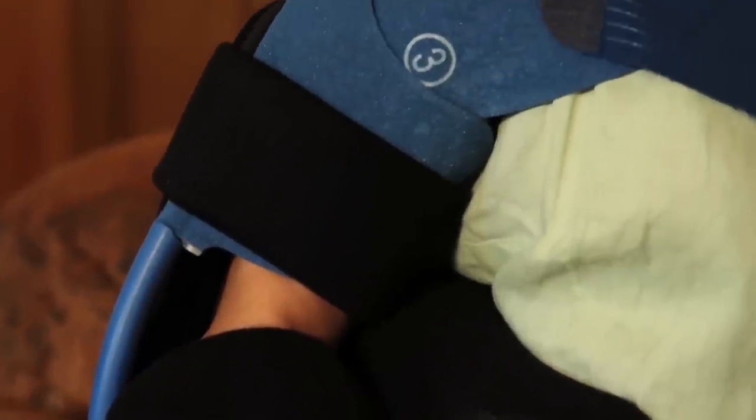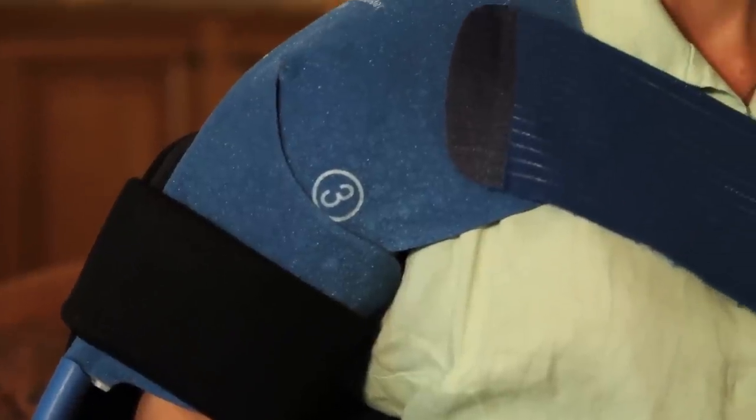The Shoulder Cradle is designed to easily accommodate cold therapy systems if your physician has prescribed it. Simply place the cold therapy pad prior to closing the upper arm strap.